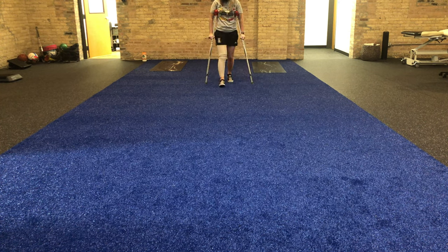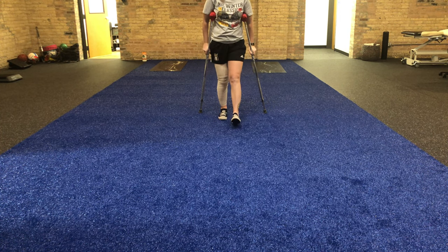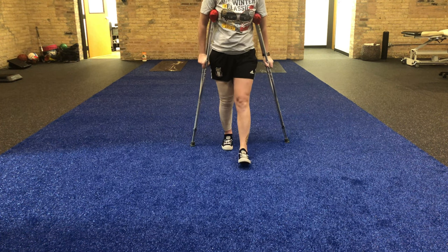So on the heel strike, really try to activate through that quadriceps. Squeeze that knee straight. That's going to help us get rid of these crutches.